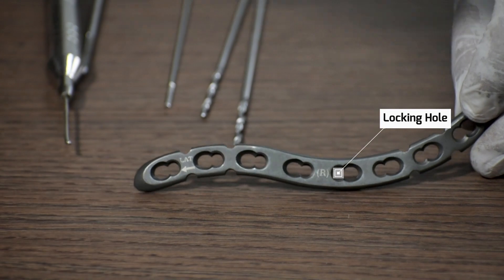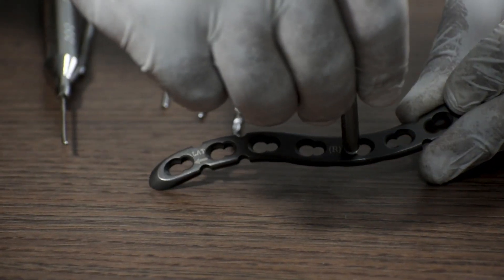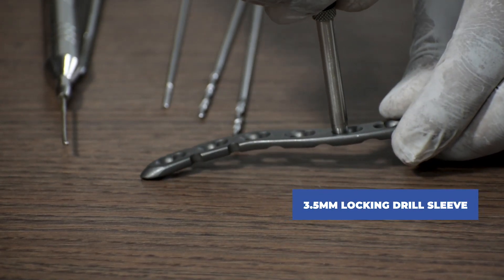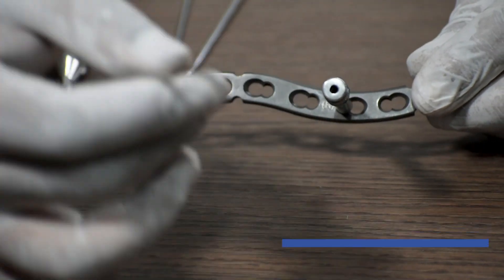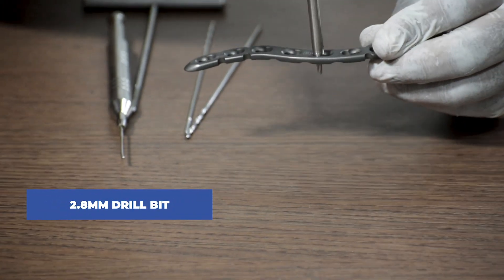This is the locking hole. How do you differentiate between a locking hole and a non-locking hole? There are threads made in the locking hole for the locking drill sleeve to get attached. For instance, we are fixing a 3.5 mm locking drill sleeve, and then we will use a 2.8 mm drill bit to drill through the drill sleeve.